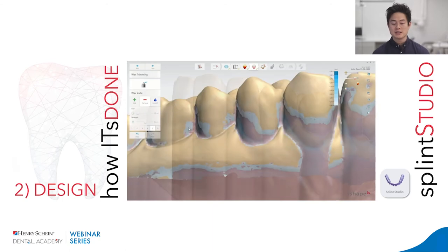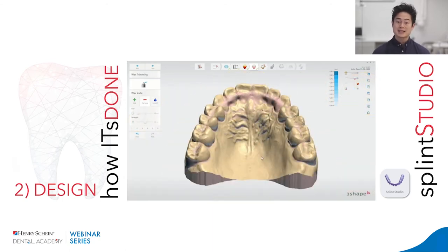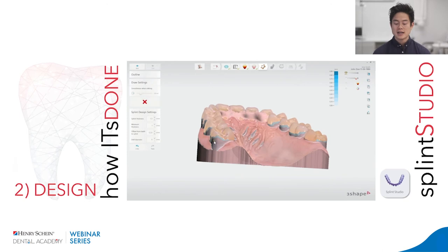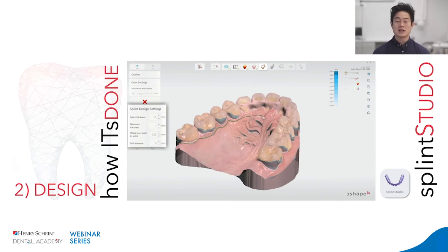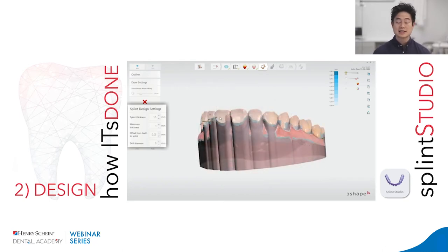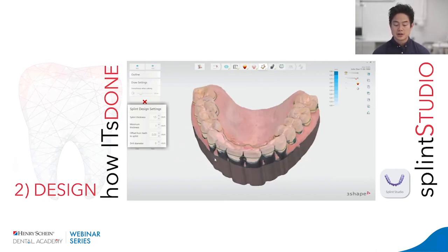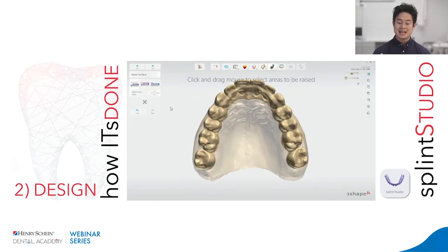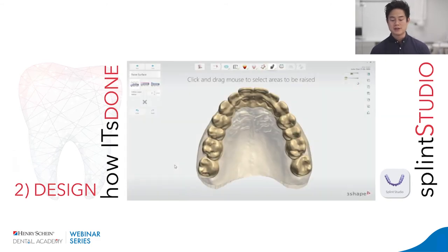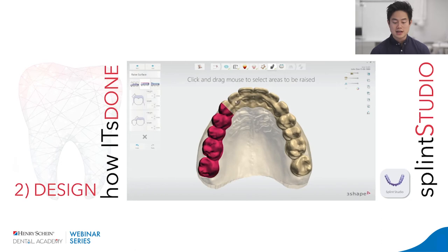After surveying and blocking out undercuts, you outline the shape of the splint — covering the palate as much or as little as you want, going up on the teeth wherever needed. The computer then designs it based on your outline. Then you select the plane of occlusion: flat plane with some grooves matching the teeth, or a completely flat plane. With canine guidance you can select the whole arch. The design process is fast — down to about 8–10 minutes once you know the workflow.